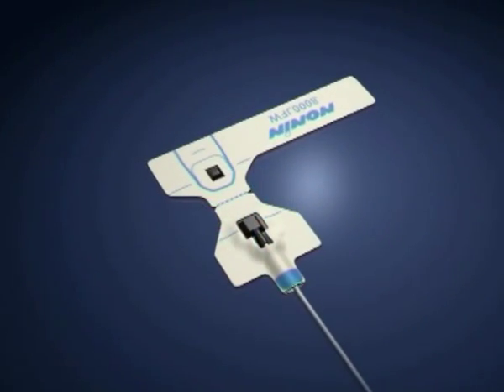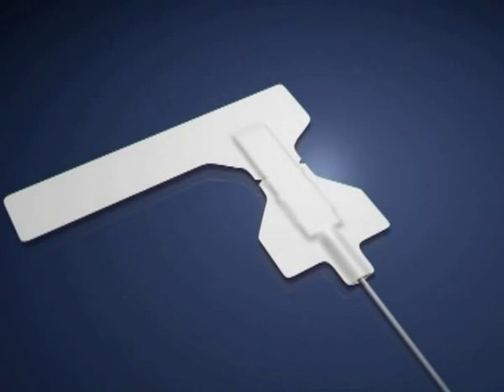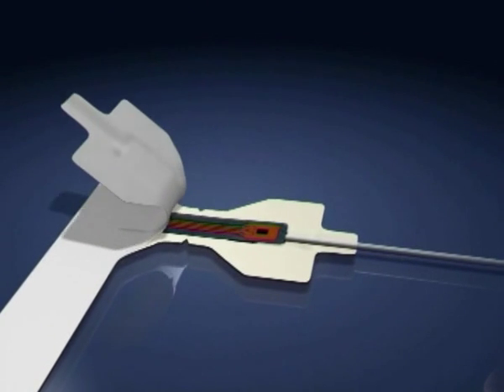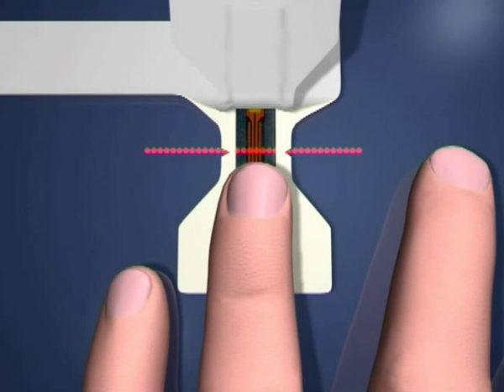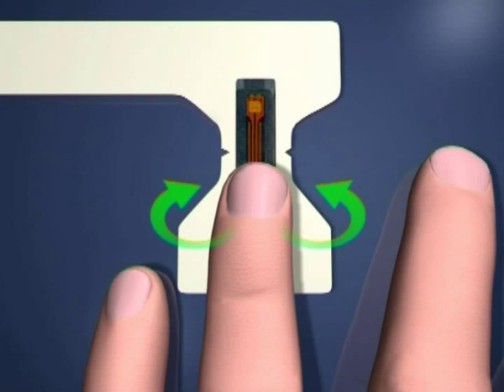First, place the sensor on a firm surface with the side with writing facing down. Next, peel off the protective backing. Now, place the tip of your ring finger just before the midline of the oximeter. And fold the side wings.